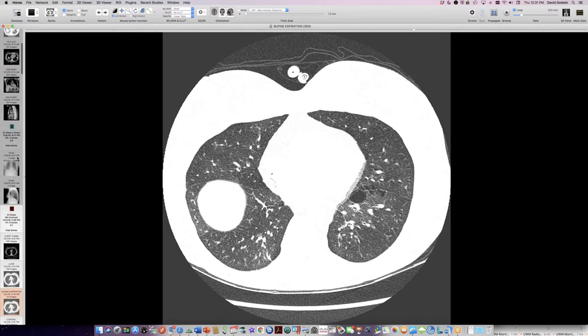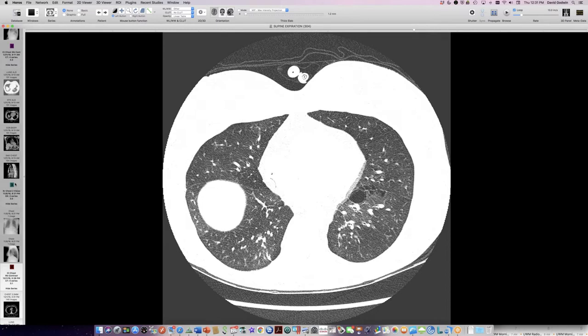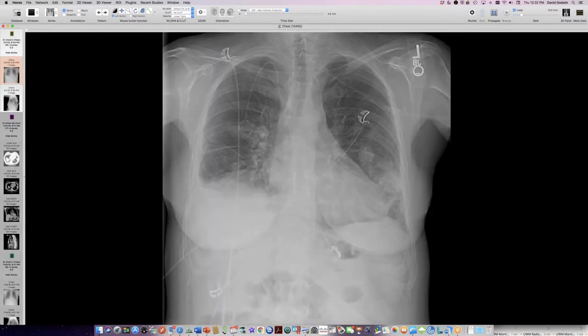So after a lung transplant, let me show you a more current chest radiograph. This is 2019 now, a few months after the lung transplant, I think about 4 months or so. She initially had much clearer lungs. Then she developed nodular abnormalities in the lung bases, some consolidation and effusion. So we've got these ill-defined nodules, patches of consolidation in the lung bases.